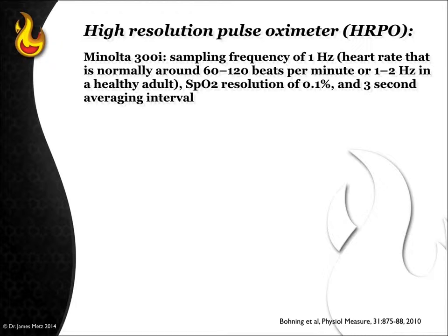The high-resolution pulse oximetry also measures the SpO2 at this 1 hertz interval. And it measures it to something very, very important in that it measures it to the 0.1%. I'm going to show you a slide a little later on as to why that 0.1% becomes extremely important.